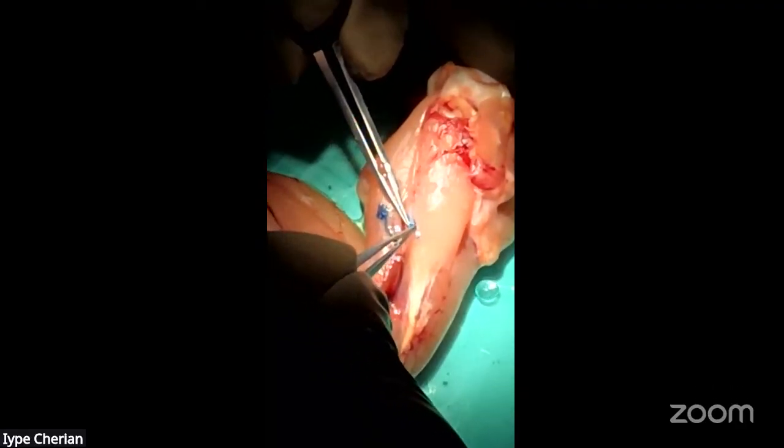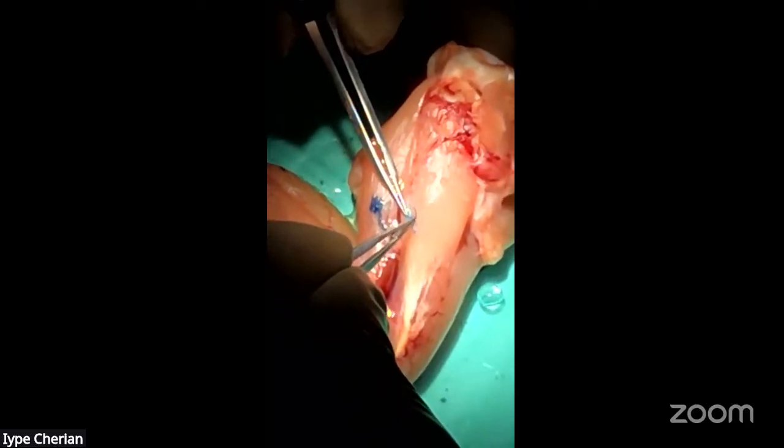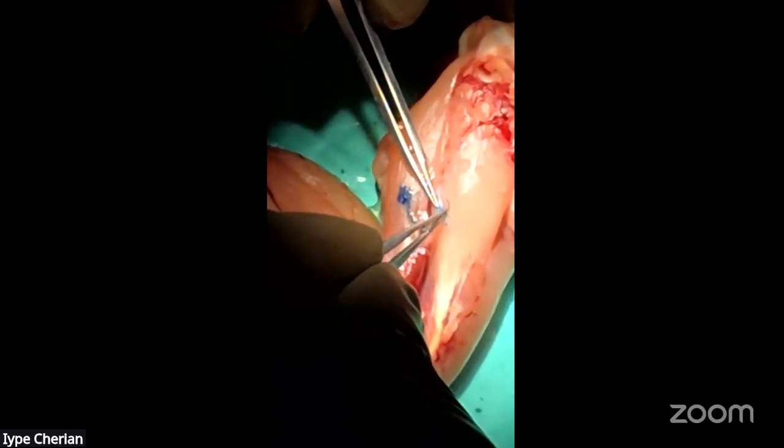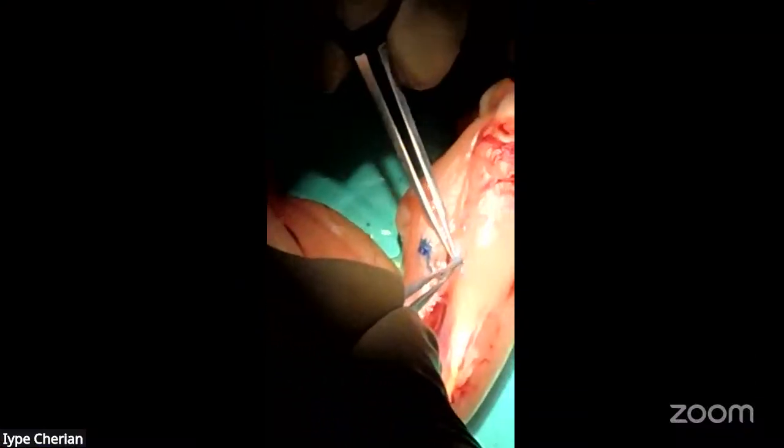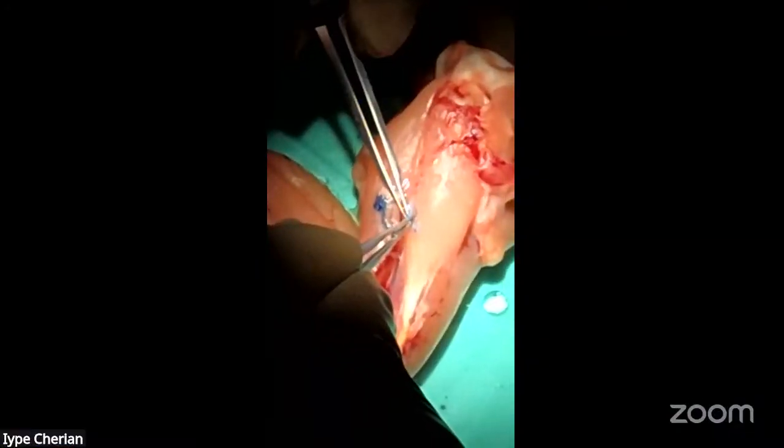John, can you see me slowly going ahead and taking more and more sutures through the wall of the graft as well as the wall of the recipient vessel? Can you see, John? Yes, very, very well.